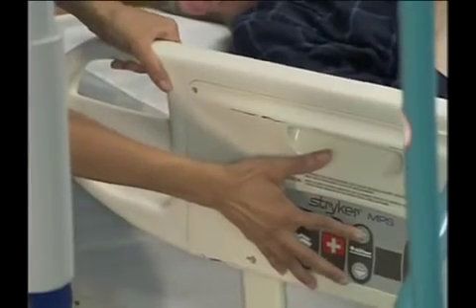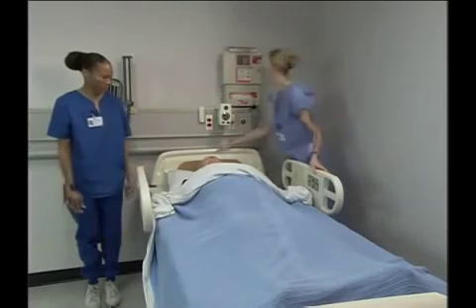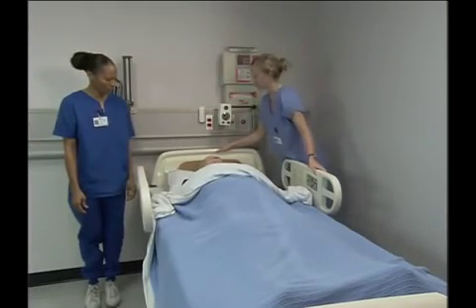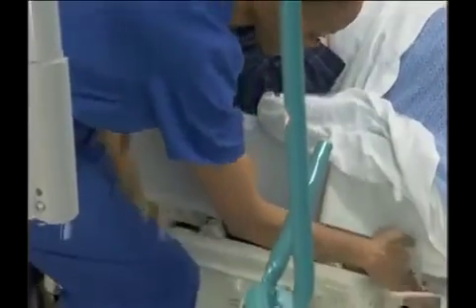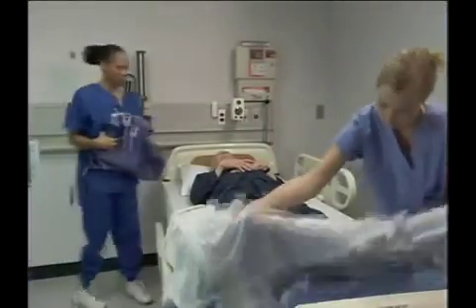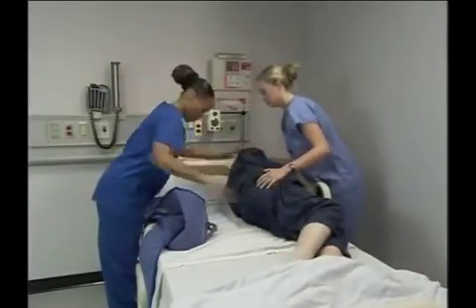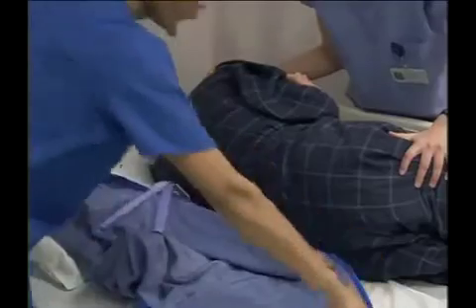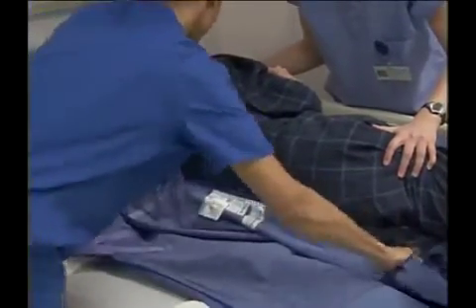Begin by making sure the bed is positioned at a comfortable working height to promote good body mechanics. Make sure the bed's wheels are locked. If the side rails are in use, lower the rail on the working side of the bed. Fan fold the top linens to the foot of the bed. Using the same technique as when placing a lift sheet while making an occupied bed, place the sling underneath the person, positioning the sling between shoulders and knees.